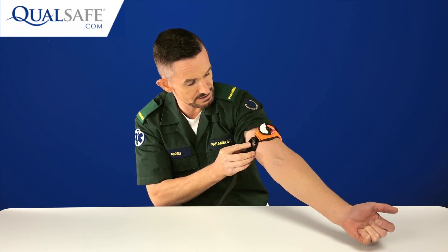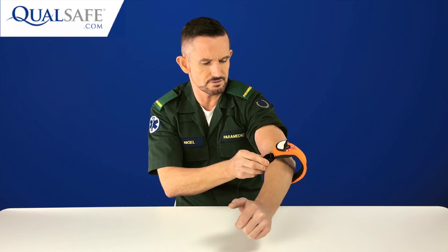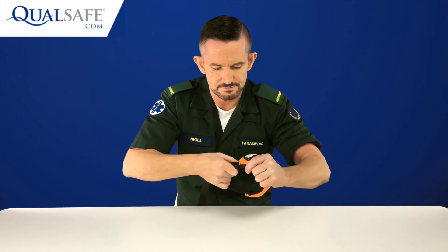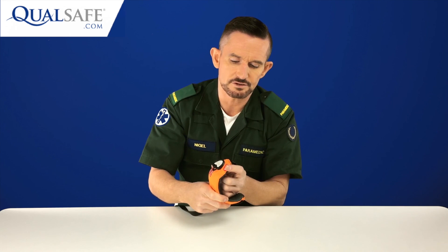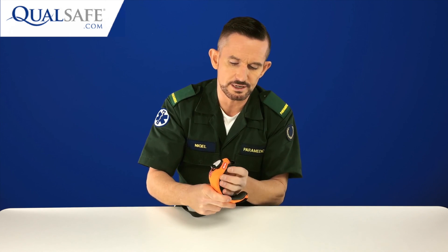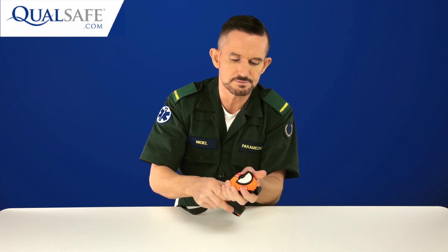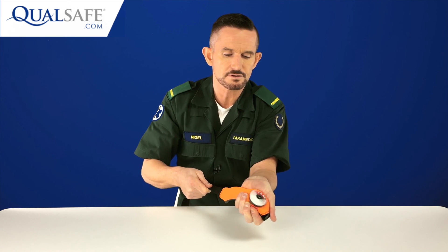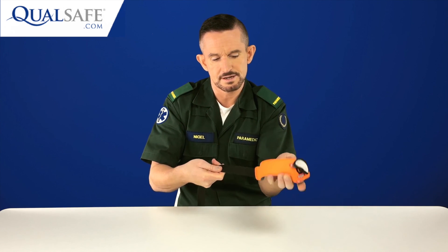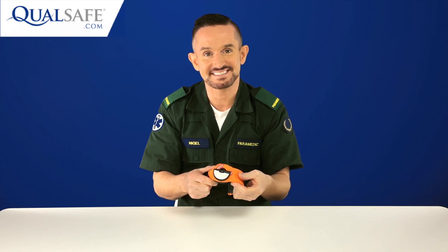To remove the MAT for training purposes, press the buckle and it comes undone easily. To reset the pulley system for the next person, press the release button and pull on the strap — you can see it spin back and the tourniquet is now reset and ready for the next student. That is the MAT tourniquet.